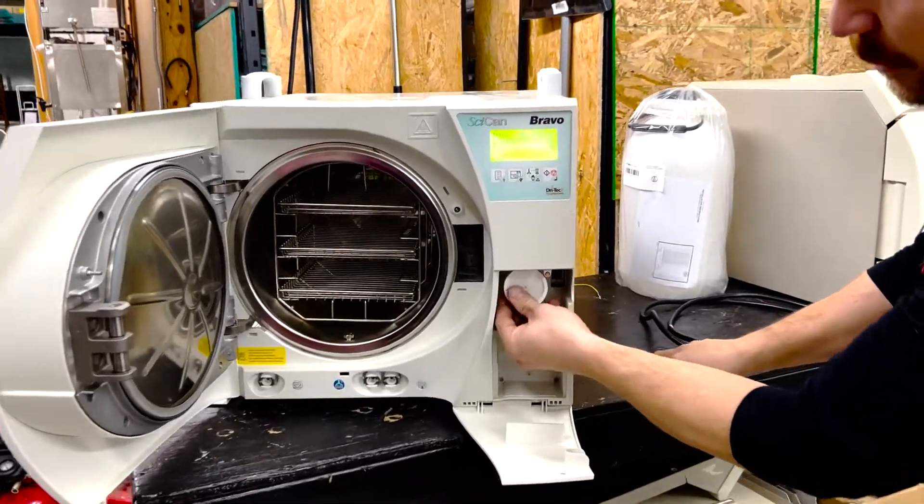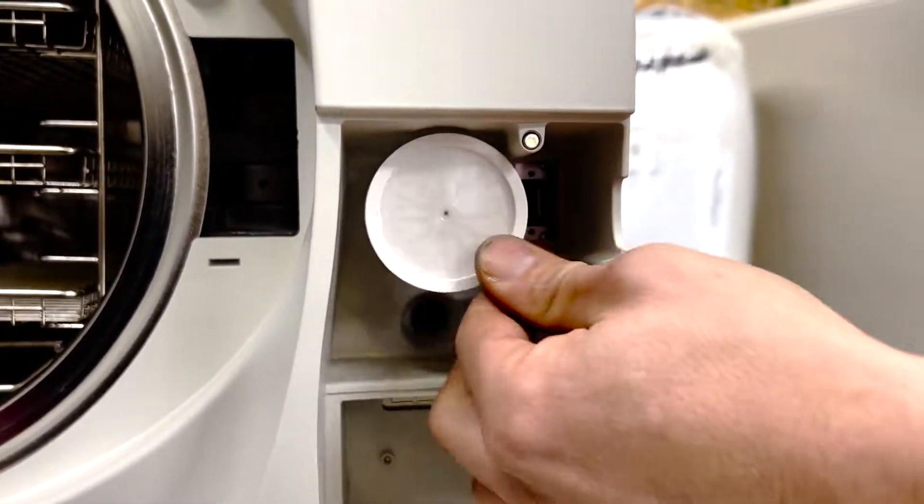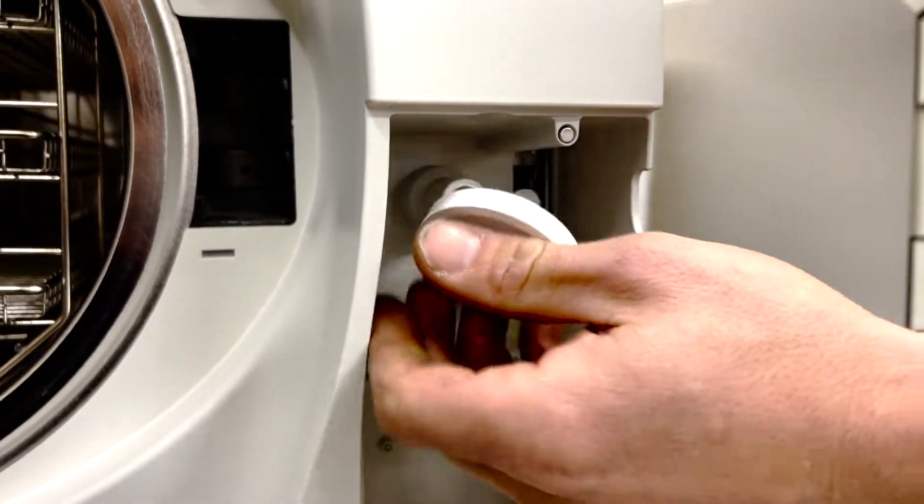Here's another preventative maintenance part — the air filter. This should also be replaced every 500 cycles or six months. What I'm doing is unscrewing it right now.